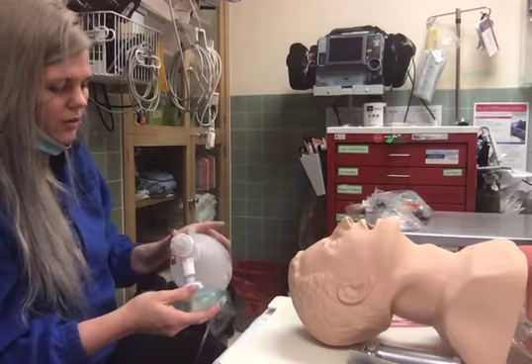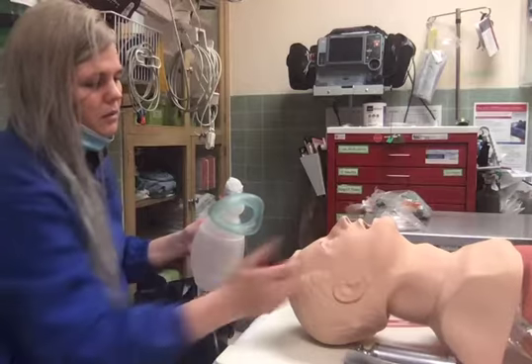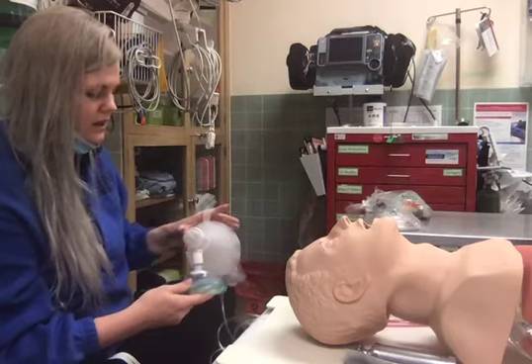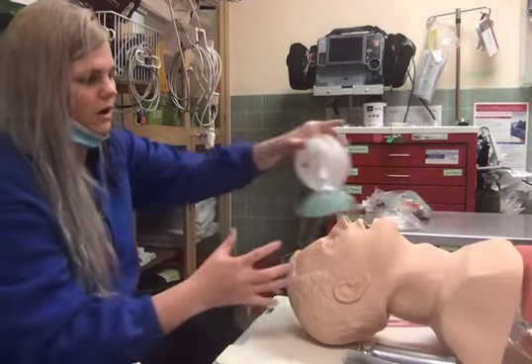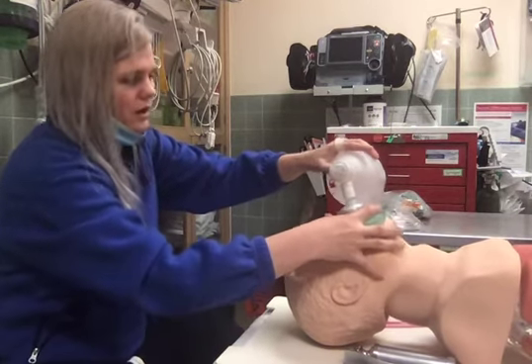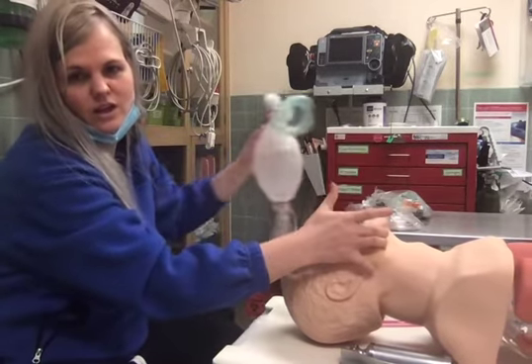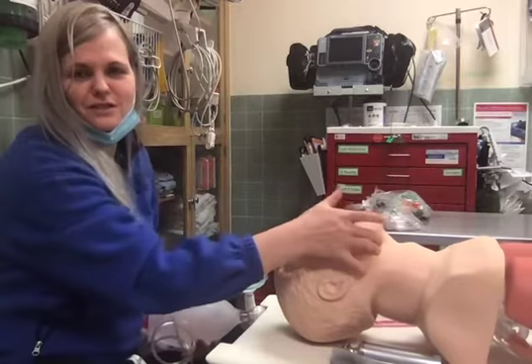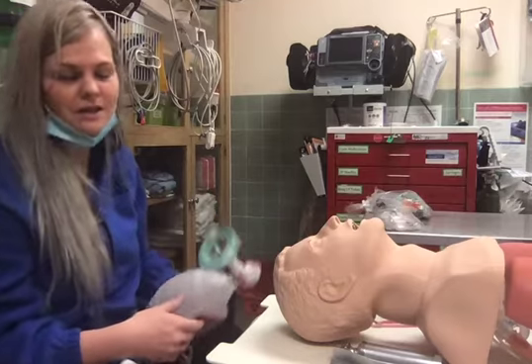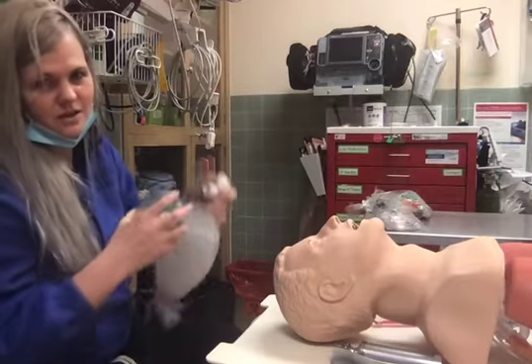And as everyone knows, this is very hard to do with just a single provider. A lot of people kind of shy away from really getting aggressive when it comes to ventilating these patients and making sure that there's a good seal. But everyone knows the CE method, and rather than push down, you want to pull up. So as you can see, I can really grab a hold of that jaw. I wasn't real aggressive until I had a CRNA tell me, you need to get a hold of that jaw, you need to pull it up, and it didn't hurt the patient. And again, this mask, as everyone knows, can come off, goes on tubes, etc.